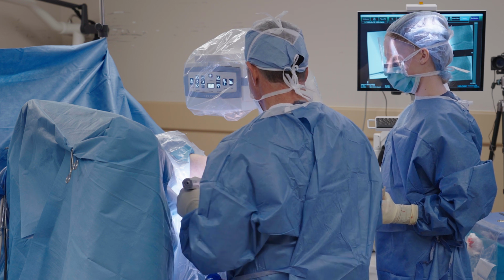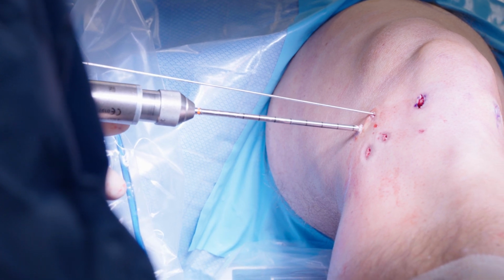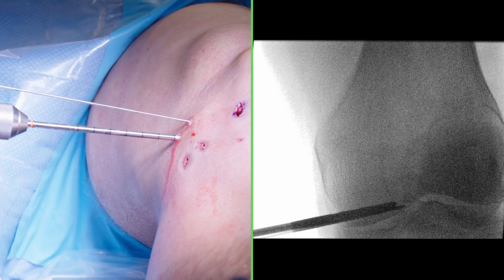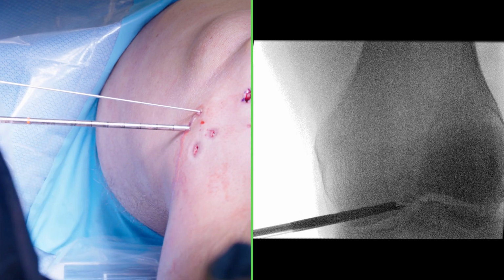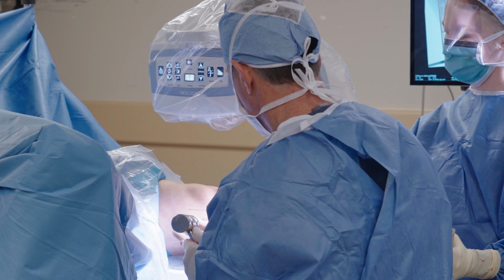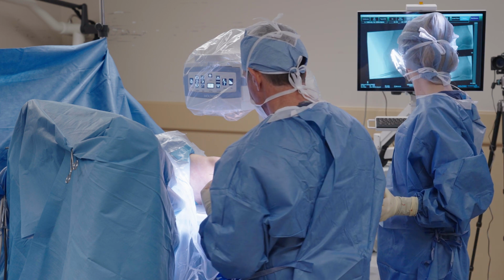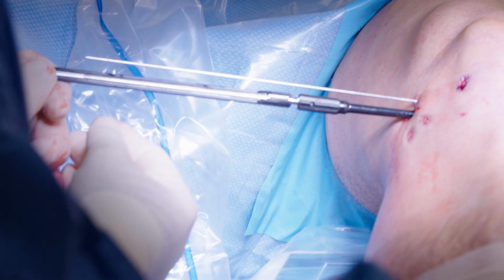Posterior one is going to be by feel. I can feel myself on the contralateral cortex. Okay, I'm going to buy that. Okay. Mallet. This will be posterior. So we'll use the indirect ruler. We know it's firmly seated in the other cortex. Okay, so we'll use 28 for posterior.